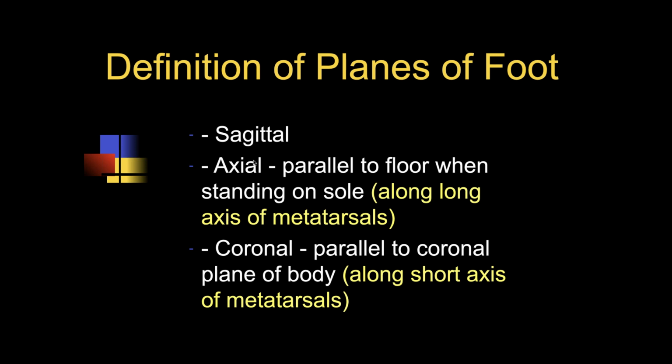If you use the axial plane, make sure it fits with the standard anatomic definition, which would be along the axis of the long bones of the foot. Or in the foot, you should just talk about long axis and short axis with respect to the metatarsal so there's not a confusion.